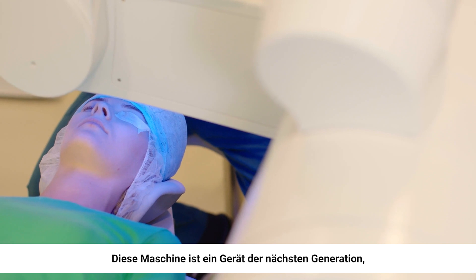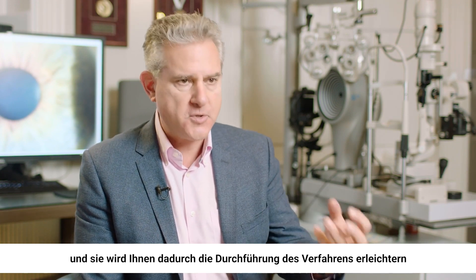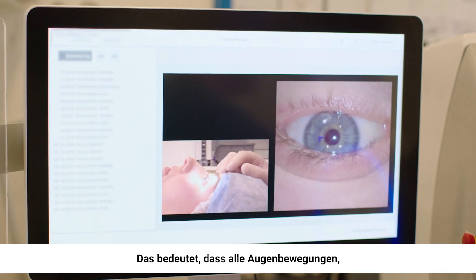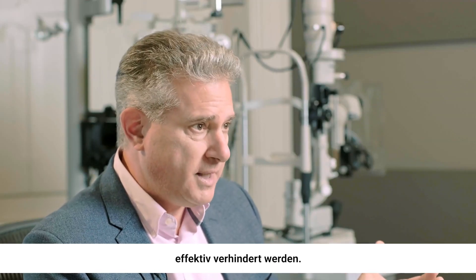This machine is a next generation device. That'll bring you ease of performing the procedure because of the added tools that are in there — the centration, the cyclotorsion, and the speed of lenticule creation. It means that any eye movements that might occur during the cutting are effectively eliminated.